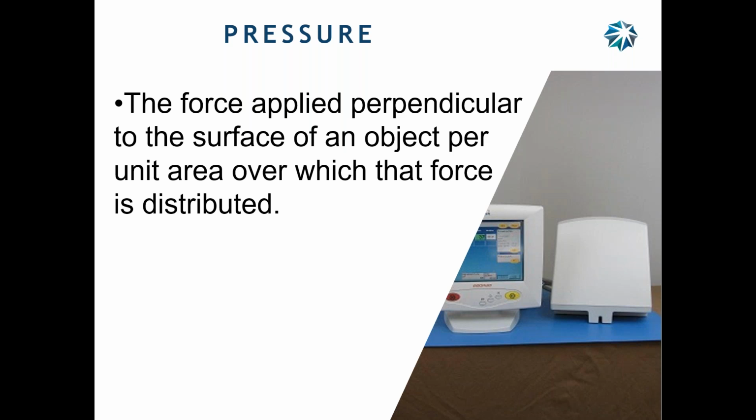And if you're working on a CT one, this is a CTA, there's the motor. Why? Because you're only going up to 10 milliliters per second. This goes up to 20, but even on larger ones, about the same size motor, it'll go up to 50 milliliters per second through a small tube, then into a 22 gauge catheter, then into a smaller catheter that's going into the heart. So where's the pressure on these injectors?